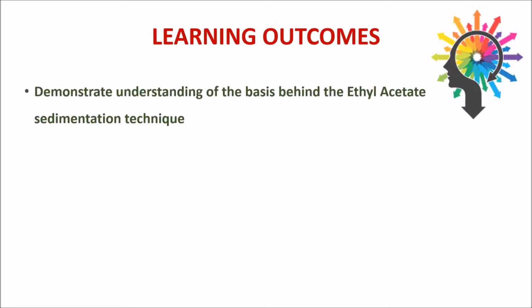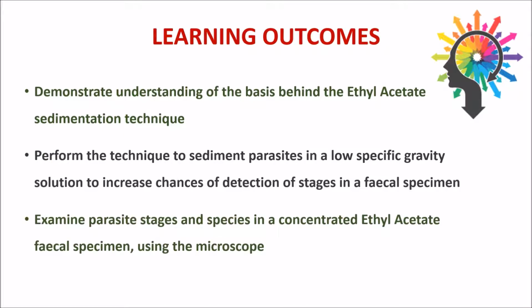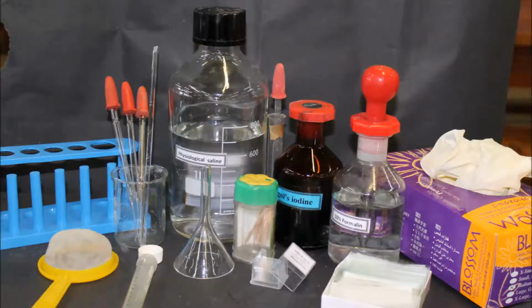These are the learning outcomes of this exercise. The materials required for the procedure are shown here.